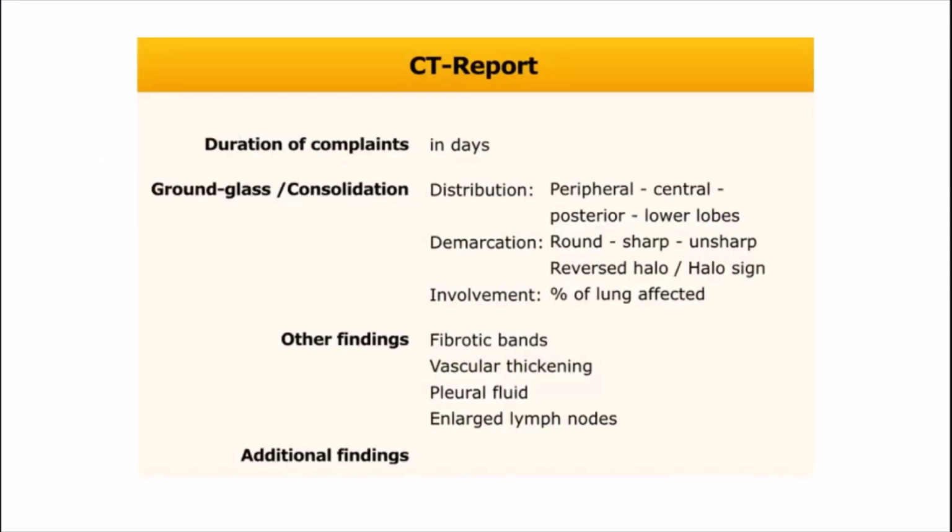The standard CT report should have the following information: the duration of complaints, because as I mentioned, there are temporal changes according to the disease stage.